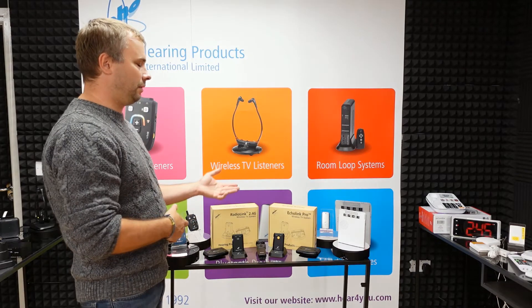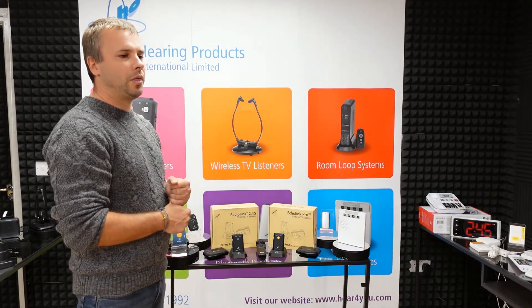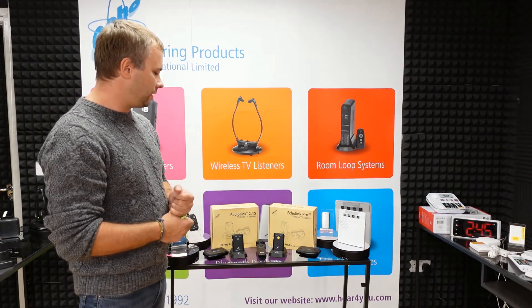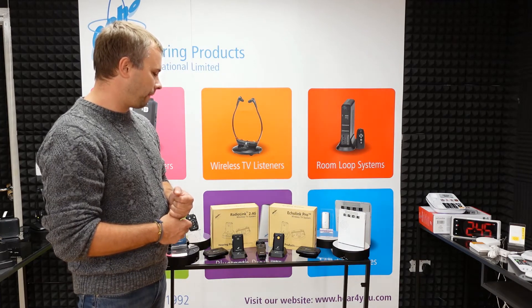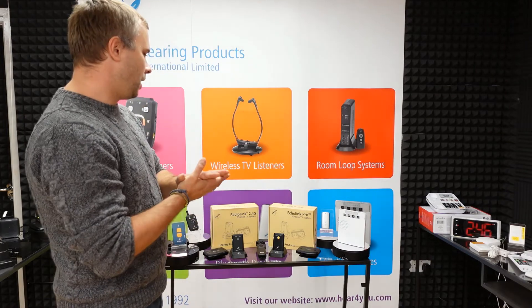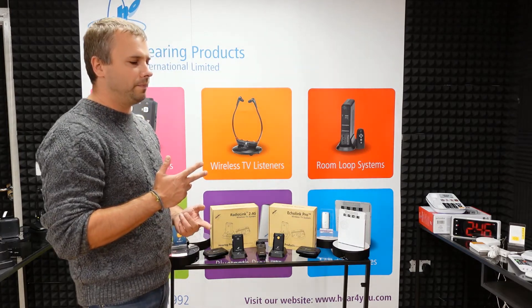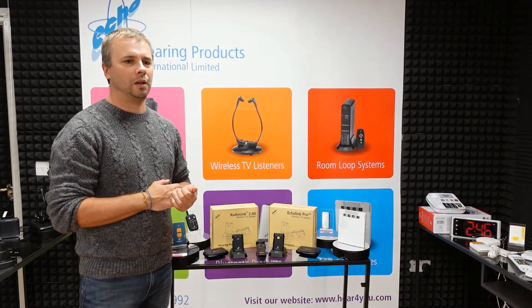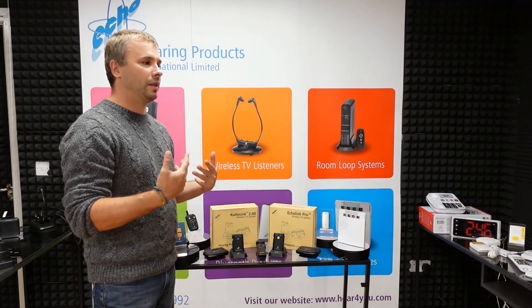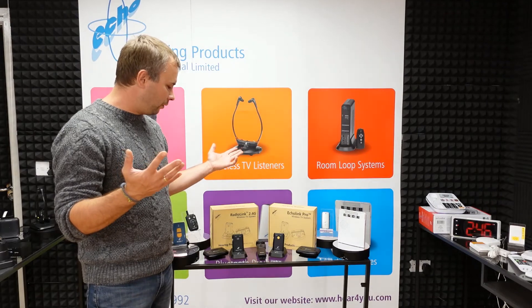Obviously how much you want to spend matters too, since Echolink Pro is cheaper. The sound quality with both is great. Battery life is up to 30 hours with the headset on both units, which is also great. Both units come with the same accessories: transmitter, receiver, charging leads, all cables you need — both analog cables and an optical cable — plus power adapters. Everything you need to connect the unit to your TV is included in the set.